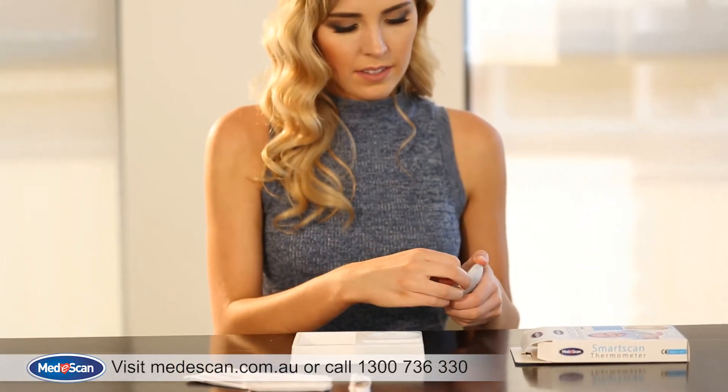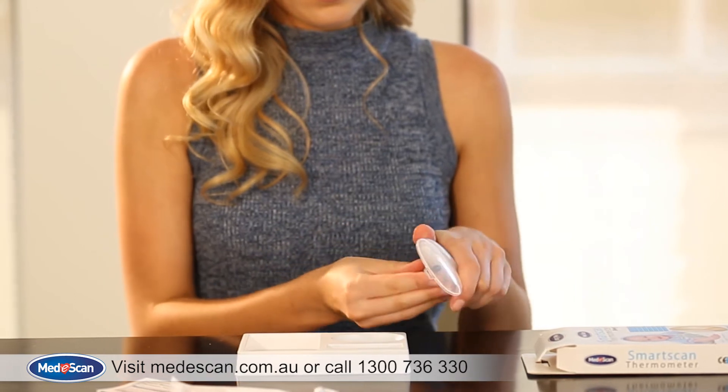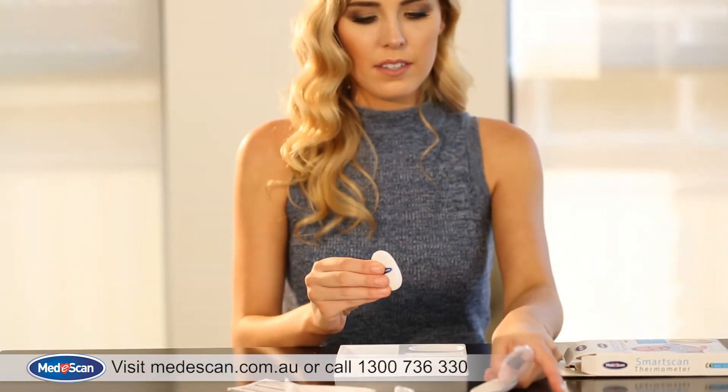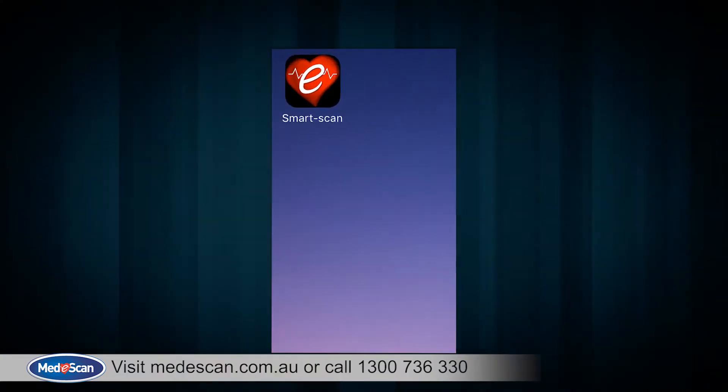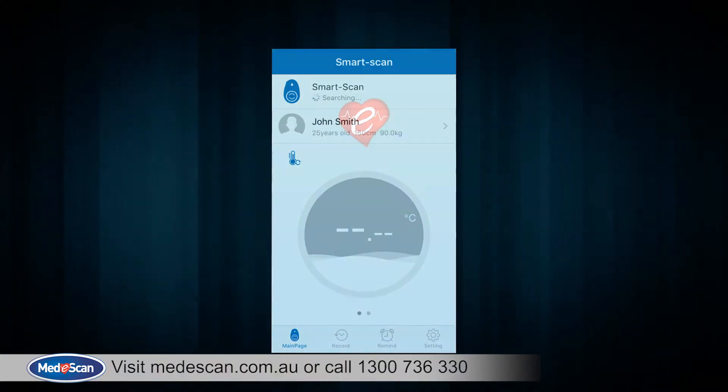To switch on your SmartScan thermometer, simply remove it from its carry case. With your Bluetooth connection turned on, click on the app and it will automatically start searching for a nearby SmartScan thermometer.